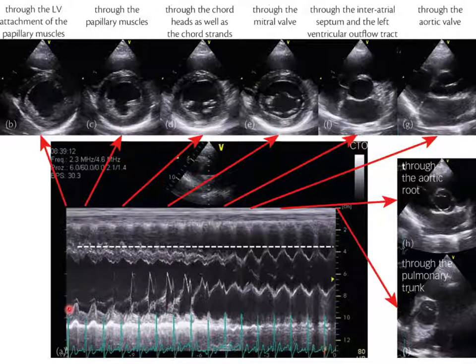And so you see the left ventricular contraction. This chamber changes its dimension as a function of time. It gets smaller here, then it opens up when you have diastole or filling. This is the EKG, the blue signal down here. So that's the ventricular signal here, and then the distance between this white signal right here and this signal right here is the wall thickness, the myocardial wall thickness as a function of time. So this is the diastolic wall thickness here, end systolic here. Okay.